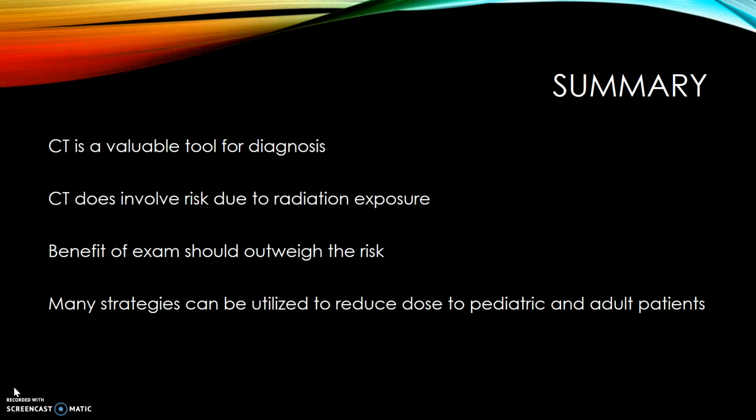In summary, CT is a valuable tool for diagnosis. CT does involve risk due to radiation exposure, but the benefit of the exam should outweigh the risk. There are many strategies that can be utilized to reduce dose to pediatric and adult patients.